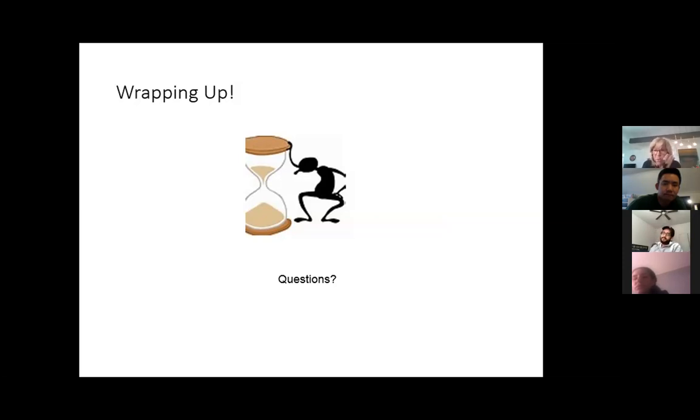You have to do it yourself as a physician, unless you have somebody you can control the lab and make the staff do these tasks. Anyway, I had like 20 actigraphs in my heyday, and my patients lost them. Their dogs ate them. They didn't return them. They broke. And I didn't have any more Bank of Rosen slush funds, and I gave up. Because we used to do this with the fellows. I used to be able to teach you how to read them, and now I can't do it because we're all out of them. They're all broke. And I'm not going to spend any more money.